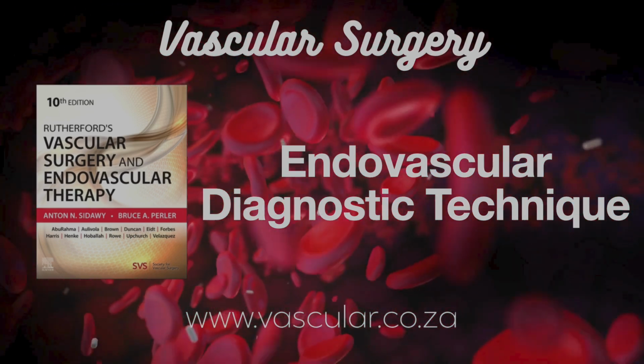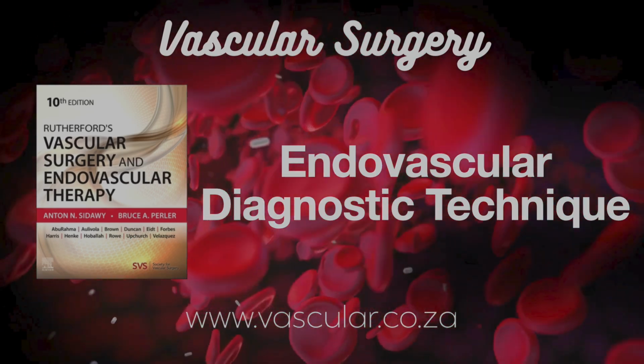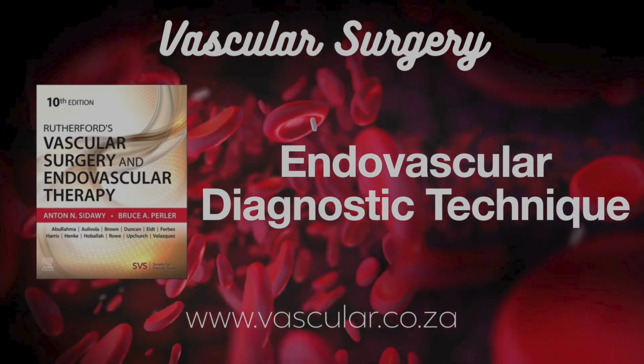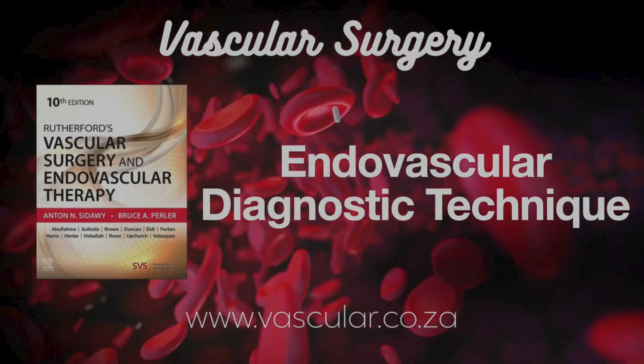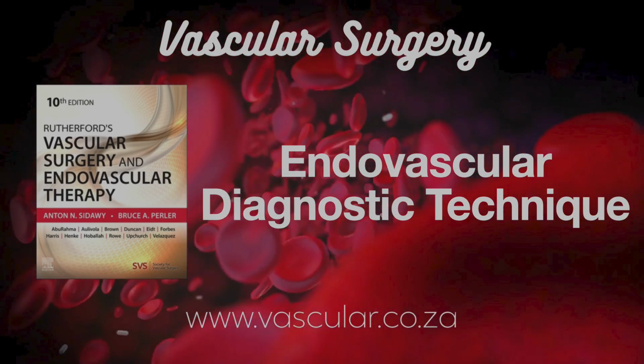Usually need selective branch vessel angiography, but you do the arch shot first. Why first? It's your road map. Shows the anatomy, but also crucially helps assess if it's safe to try selective cannulation. You look for disease at the origins that might break off, increase embolization risk.